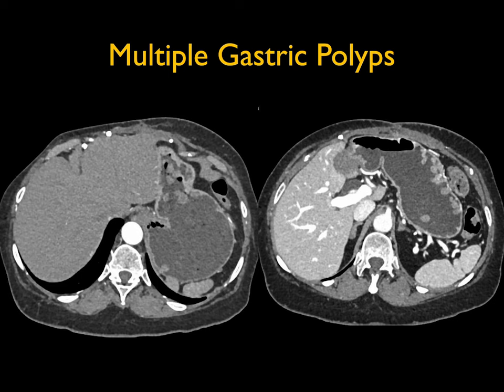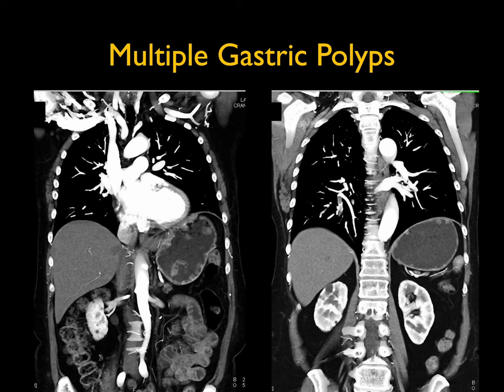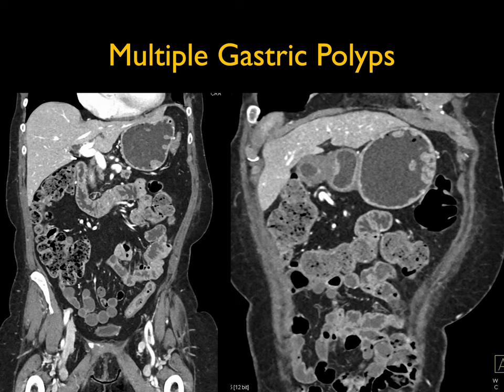We also think about multiple enhancing lesions in the stomach — gastrinomas with multiple gastric carcinoid tumors. They tend to be very vascular. Looking at some of the images here, there is very nice visualization of the lesions with good gastric distension. You can see it nicely on the coronal views, particularly in the fundus and body of the stomach. The lesions are very nicely shown.